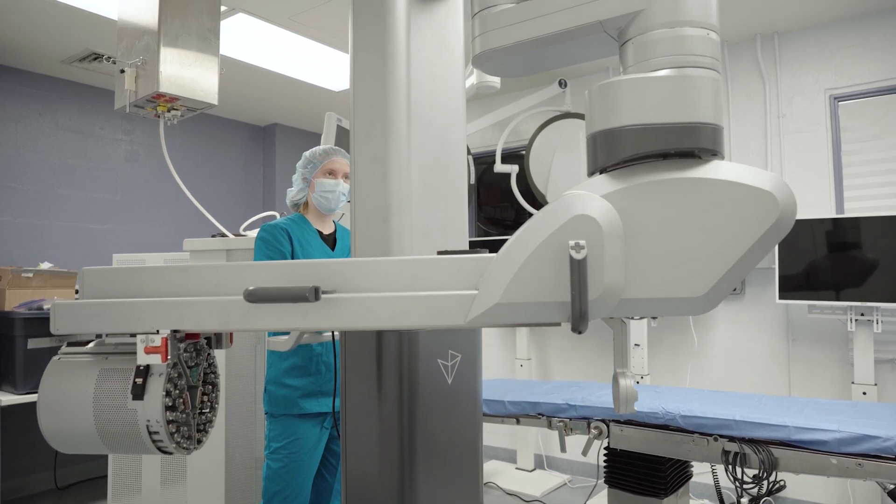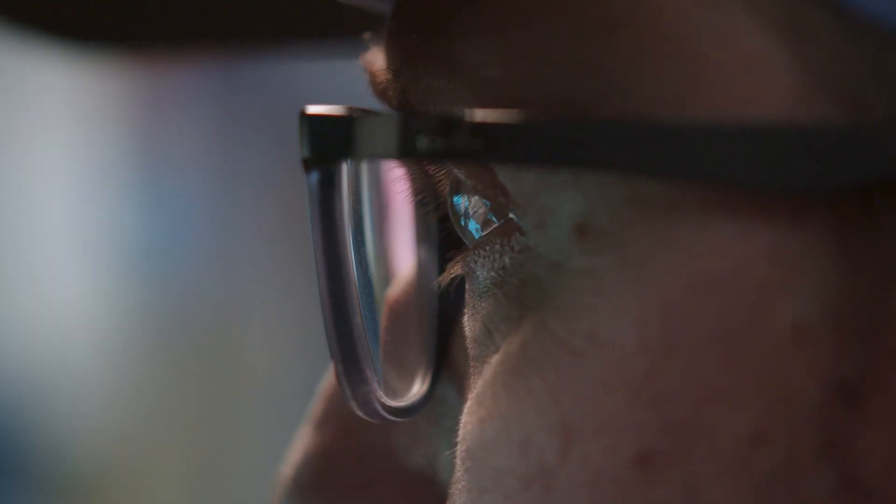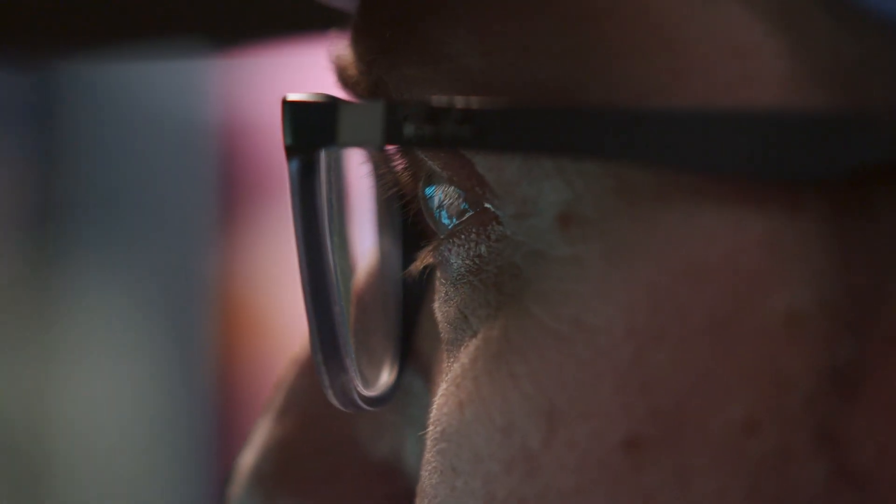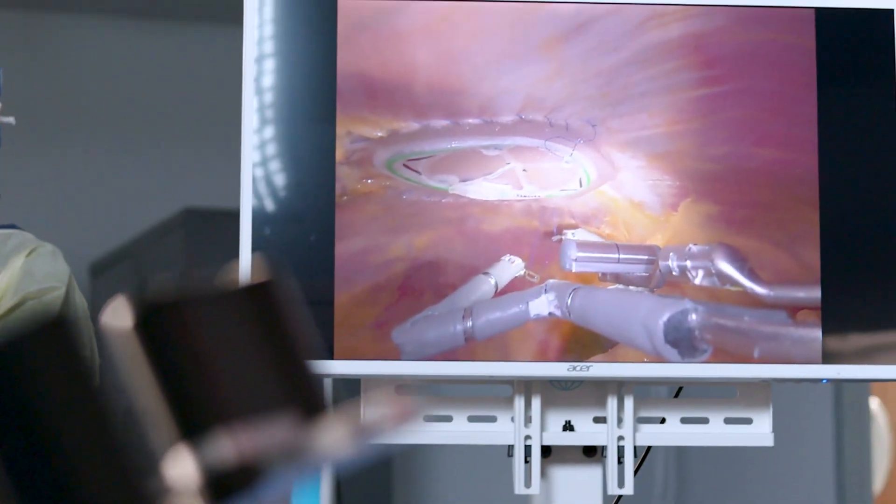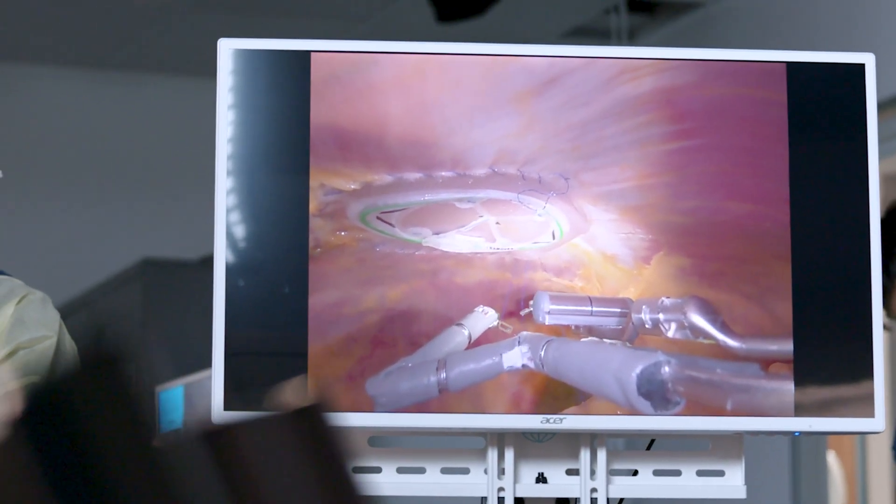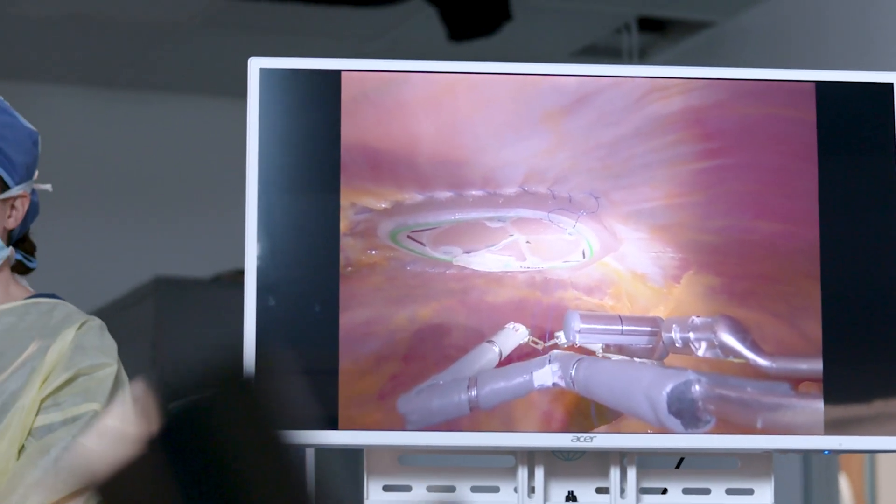This efficient design enables easy access around the patient, improves workflow, and saves valuable OR and training time.